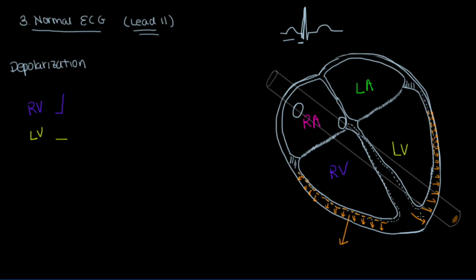And here in the left ventricle, you have a very large charge moving down this way, smaller charges kind of moving in that direction. But like overall, you'd say maybe the overall charge is moving in that direction. So if you add those two together, the elements that are pushing the arrow this way cancel out with the arrow pushing that way.